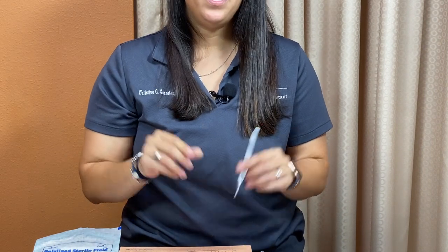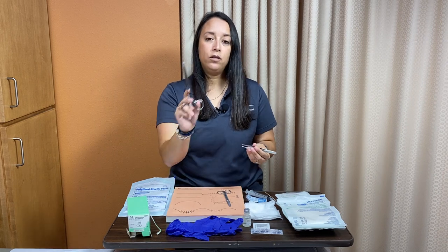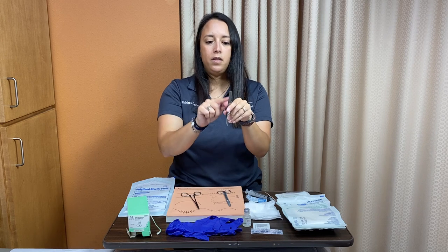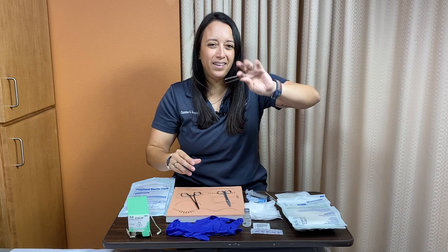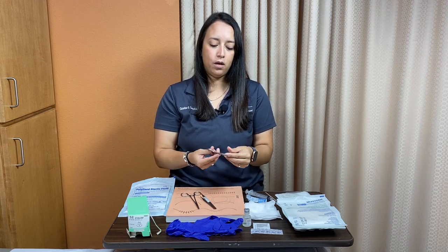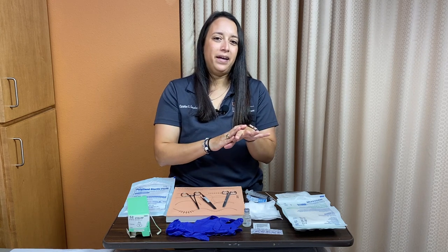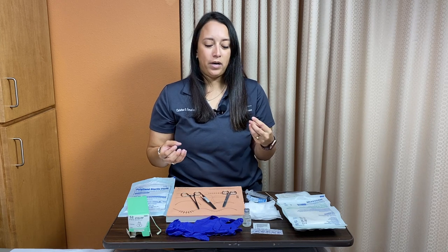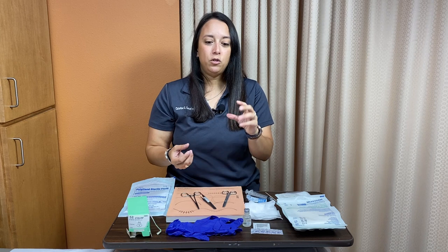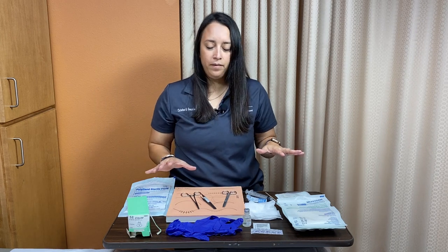Laceration trays usually come with rat-tooth forceps — little teeth on the end to grip the skin. Be gentle; you can actually tear the skin by pulling too hard with your non-dominant hand. Hold forceps in pencil grip — the same way you'd hold a pencil to write — with the top of the instrument above your finger. Your kit will also include scissors, held the same way as the needle driver. A quick tip: if your non-dominant hand isn't strong, practice ambidexterity at home — eat with your left hand, brush your teeth with it. You'd be surprised how much better your fine motor skills become.